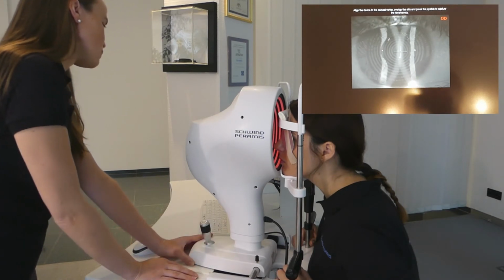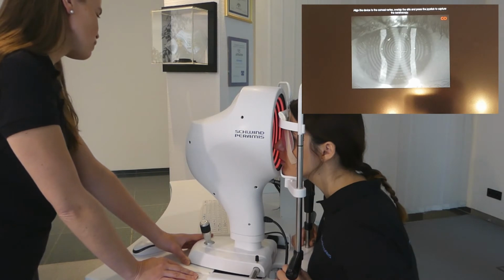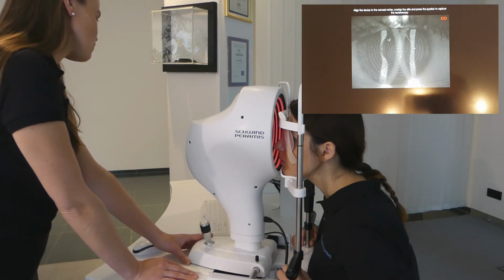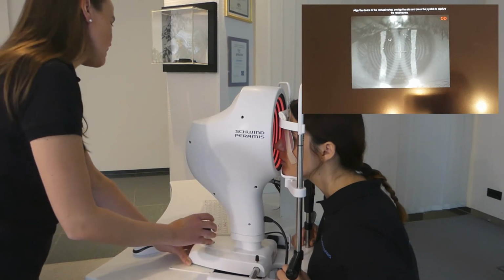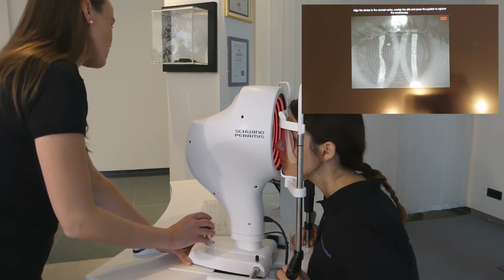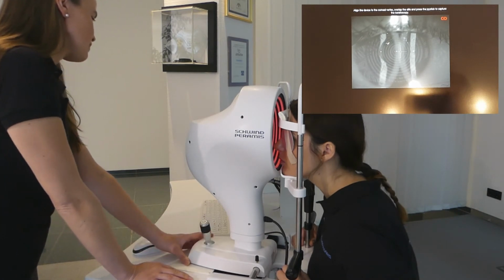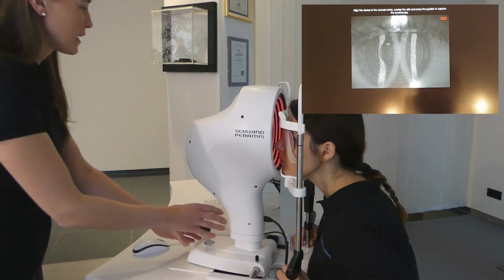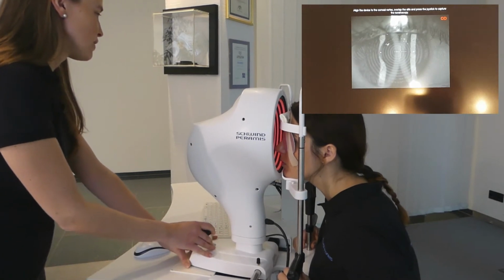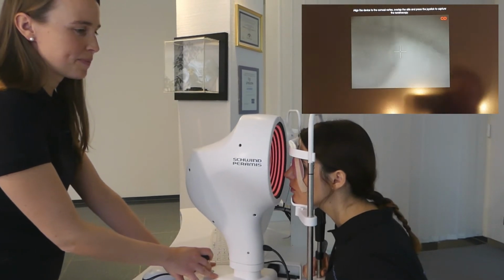Normally, you have to perform minimum 3 keratoscope measurements to check afterwards if your measurements are reliable and to select the best one for your treatment planning. This video is only for demonstration reasons, and that's why I skip the further measurements for the right eye and go ahead with the left eye.